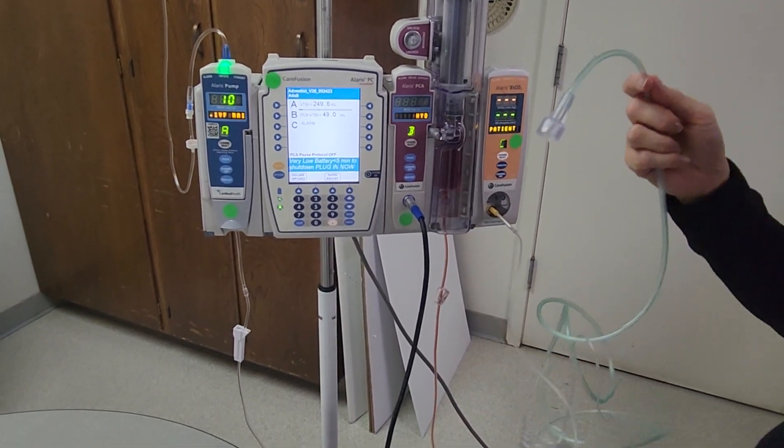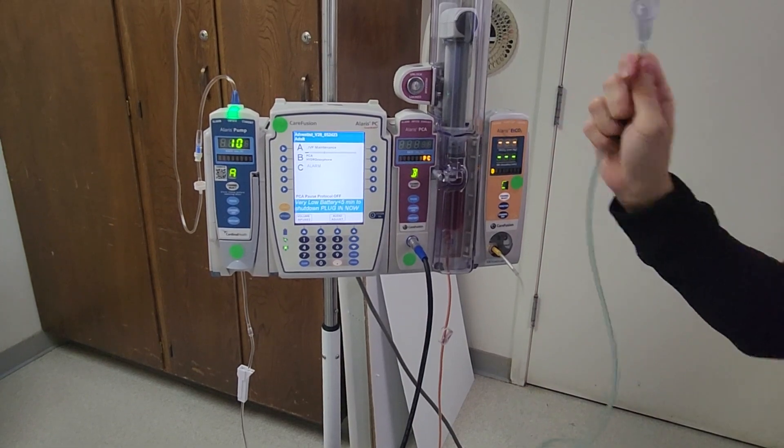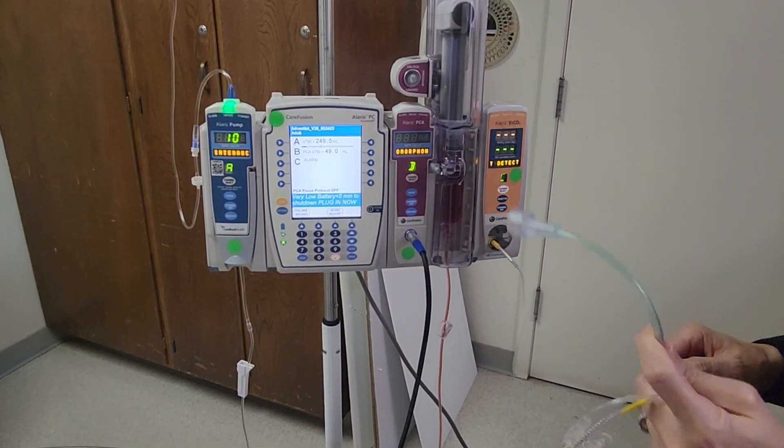If your patient needs supplemental oxygen, there is a connection here that you can connect to wall oxygen or portable oxygen.